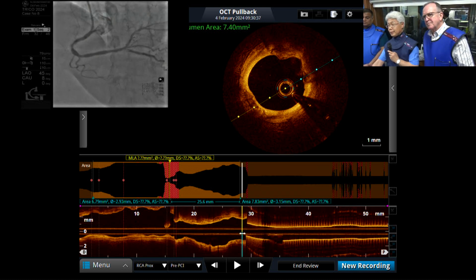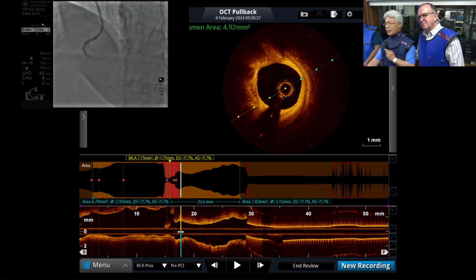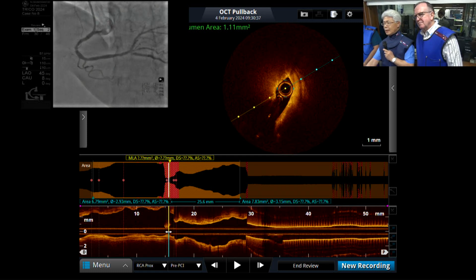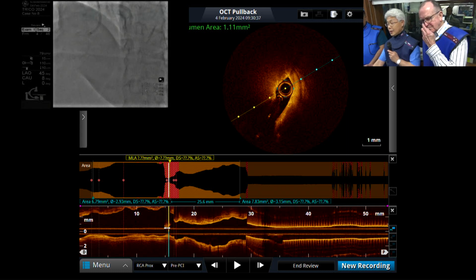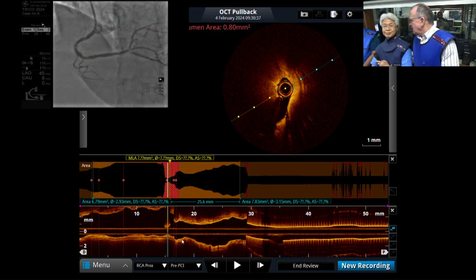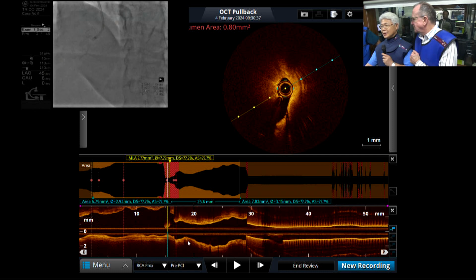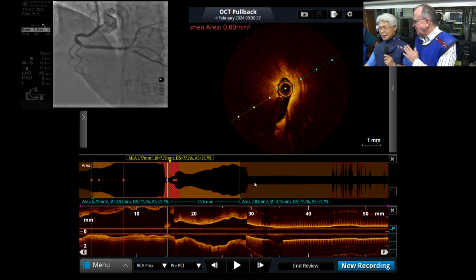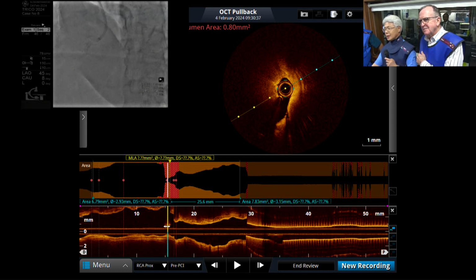Will you dilate with the balloon? You want to see and try and dilate with the balloon? Yes, I will do that. I will at least try and see. And if either the balloon ruptures or the balloon does not open up, then what? Will you consider rotablation before IVL, or will you straight away go with IVL balloon? Because IVL balloon is after all a balloon, and there are chances of rupture. We have seen a couple of ruptures with IVL balloon also.